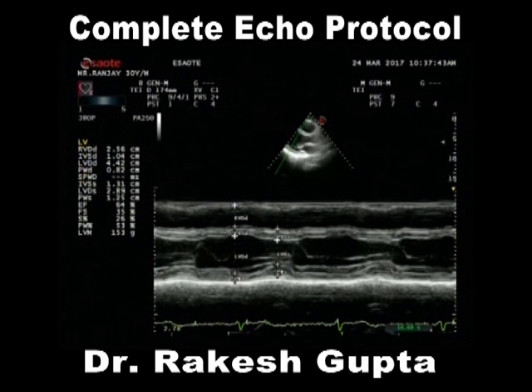And what does it give you at this particular moment? It gives you many things, like ejection fraction and fractional shortening. Then the third one is the LV mass. Now I can vouch that this is the time we are not going to consider EF over here, but we can consider fractional shortening, and LV mass is still being utilized in day-to-day practice.